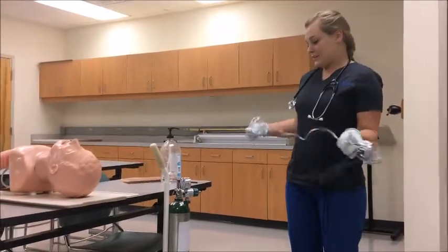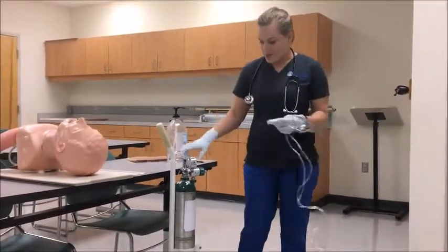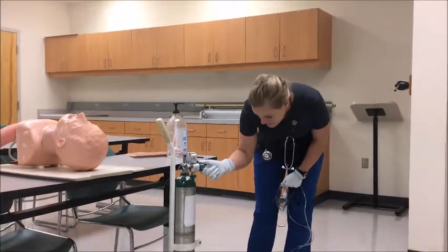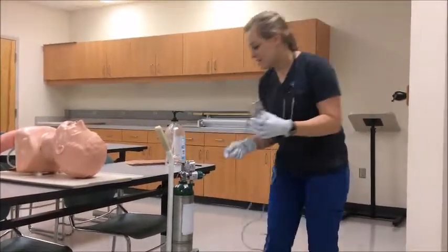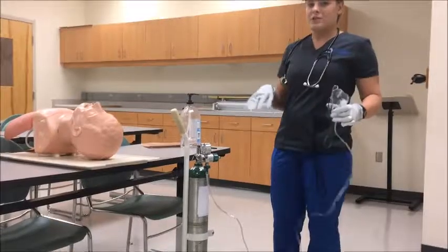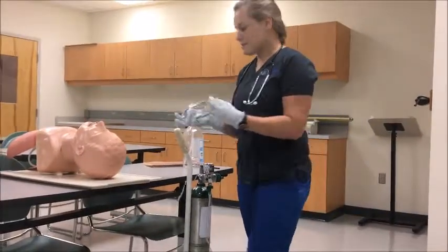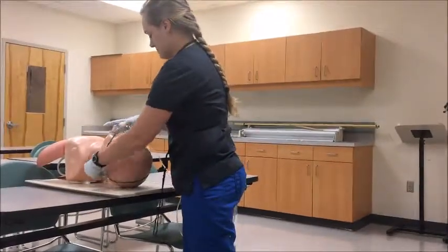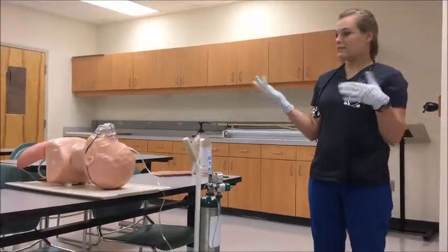For this procedure, you take your oxygen tank, put on the regulator correctly, turn it on, and make sure there's oxygen in it. Then you turn up the liter flow to whatever the doctor ordered — today it'll be 5 liters. Take the mask, attach it to the tubing, make sure everything is functioning perfectly, there are no leaks, and nothing's broken. Then place the mask on the patient.